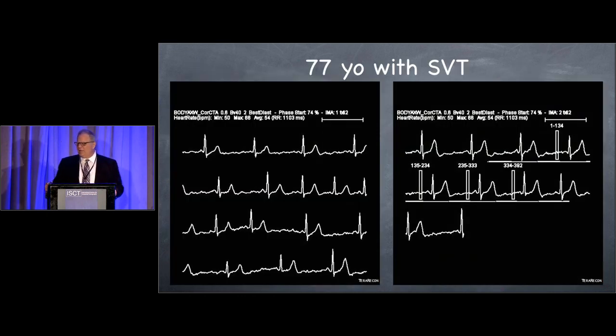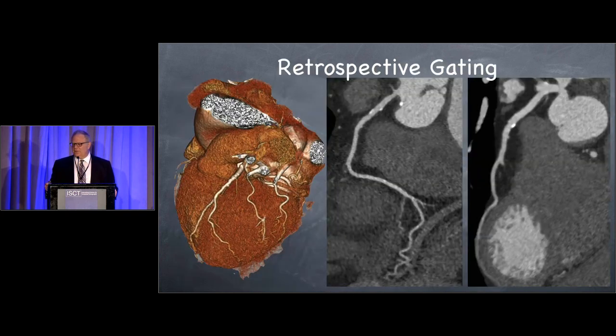Here's an example of an ECG during a CT scan that shows the acquisition. You can see the line of the ECG tracing at the end on your right, and when the line is thicker, that's when the X-ray tube is on at full strength.